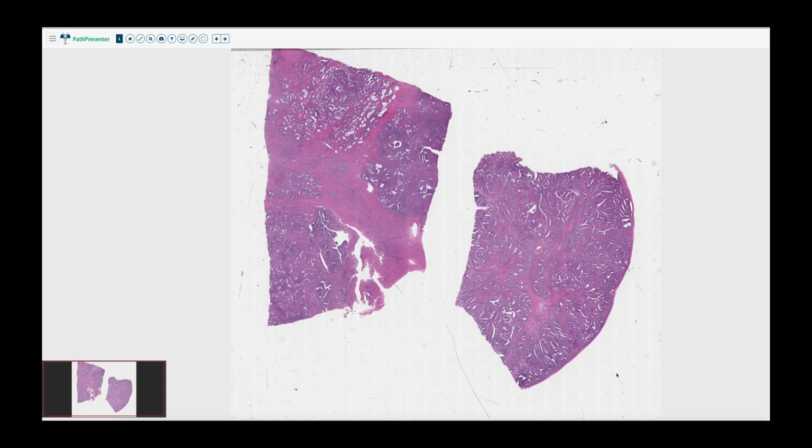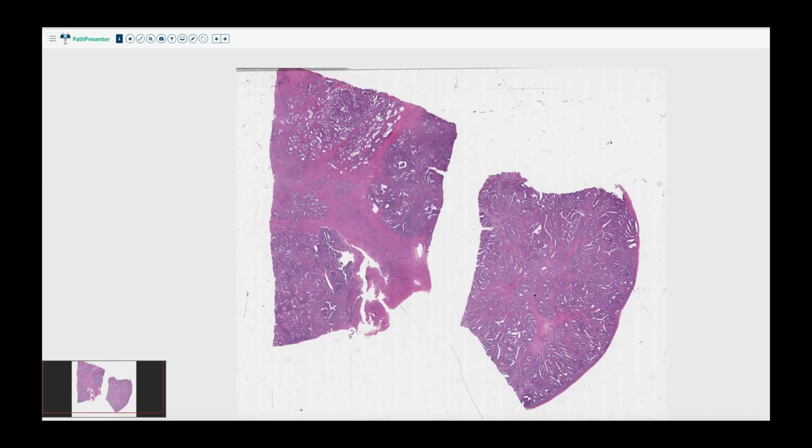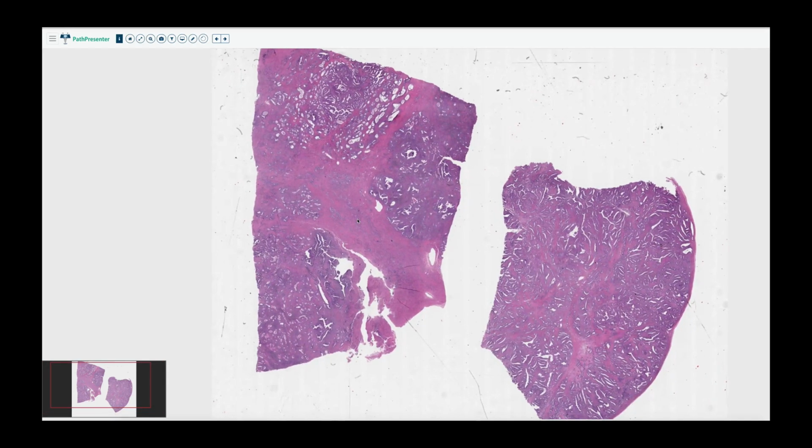This is an endometrioid adenofibroma. I can't tell that from here. I know that because this is a case from my study set, but you can see at low power, when you're approaching an ovarian neoplasm, that this was probably the outside of the ovary. This doesn't look like it has ovarian surface in it, but you can see a lot of stroma, a lot of pink stromal cells in this case.